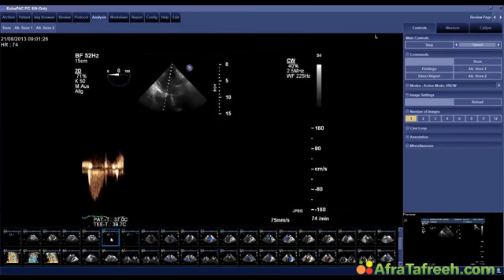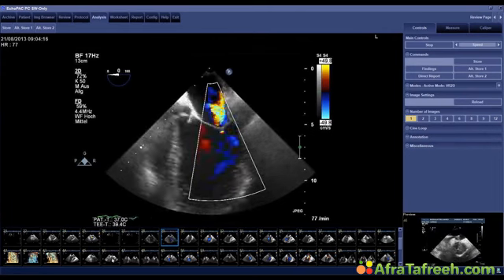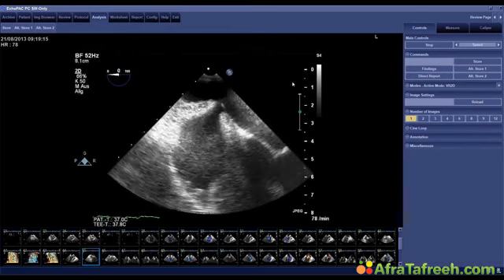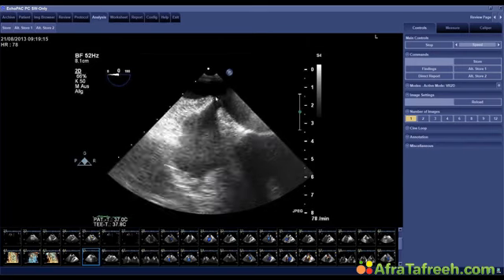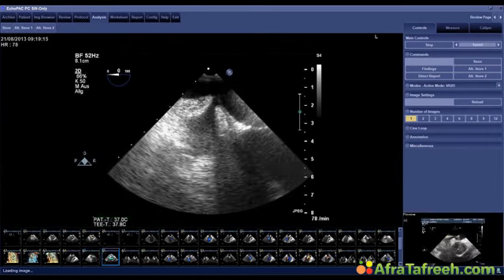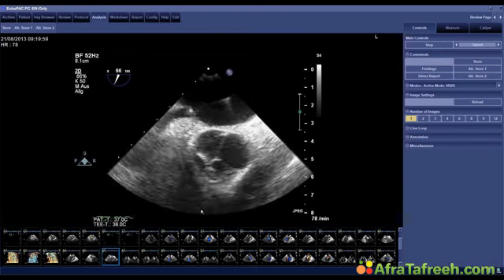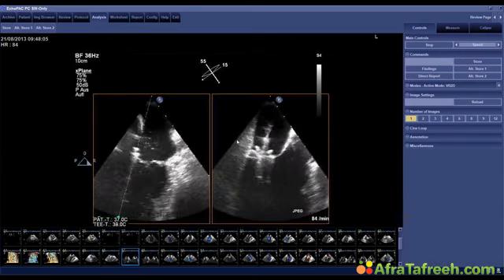Let me see where this image is. I can't find it. Well, anyway, so we perform this transeptal puncture. Here it is. Here you see there's some form of lipomatous interatrial septum. Here we have the tenting of the leaflets of the septum. Then we go through, puncture. Here we are through the interatrial septum. This is the introducing wire. And then, in essence, you approach the mitral valve.